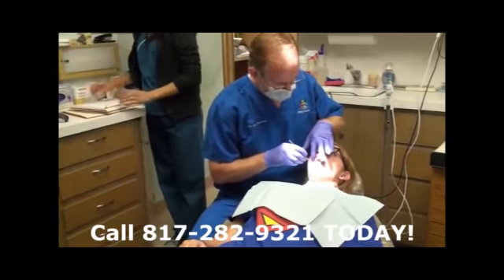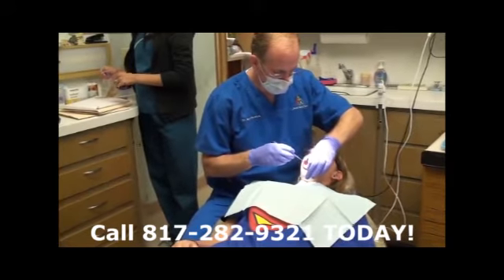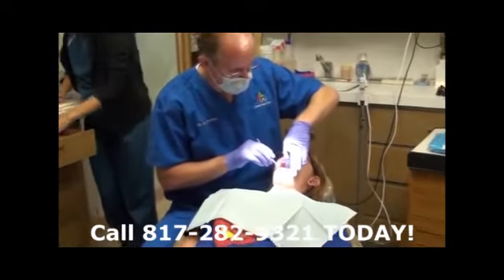Okay. So what we're going to do is I'm going to take a look at all your teeth. I'm going to look at your gums. I look at your cheeks. Look underneath your tongue.